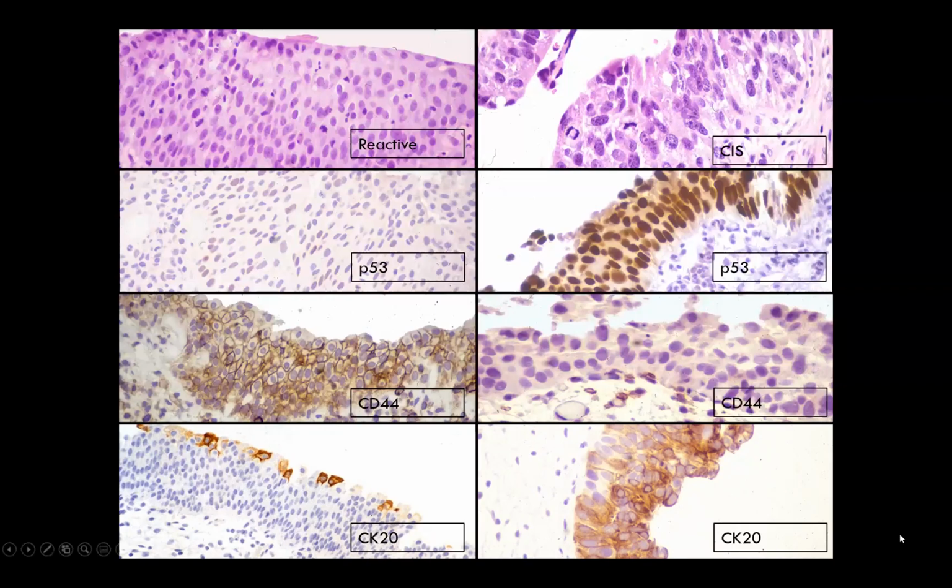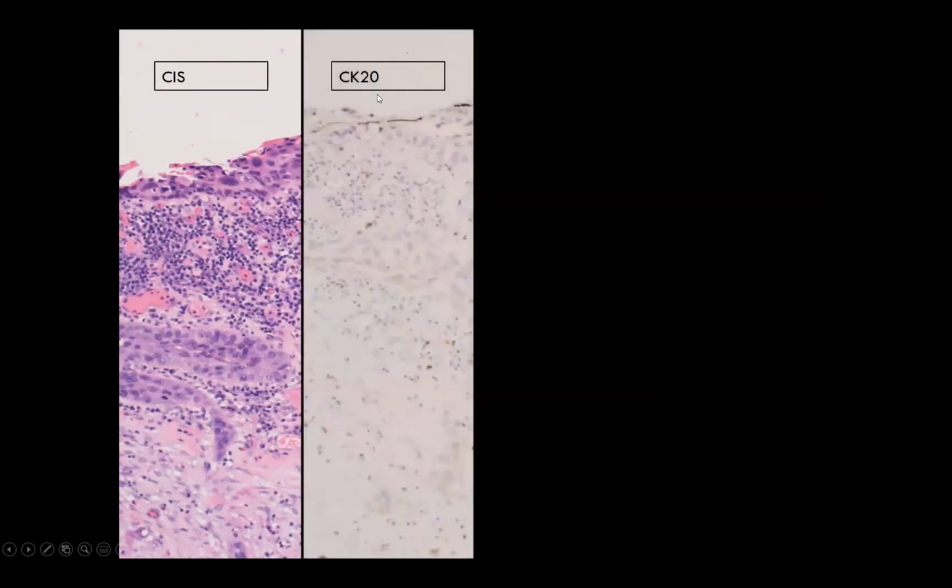Unfortunately, the answer is not that easy. So I will show you with a couple more examples. Here's another case of clear-cut carcinoma in situ with some extension into the Brunn's nest over here. And what happens when we apply these stains?